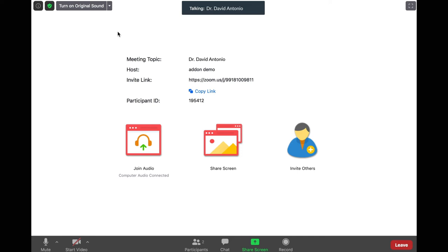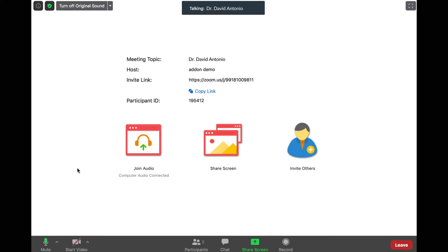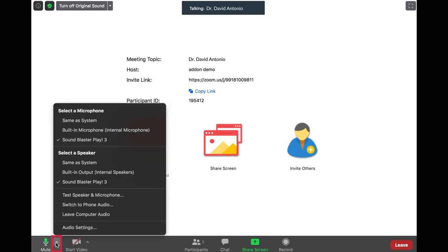When your provider is ready, plug in the device to the USB port. Enable the original sounds on the top left corner of your zoom screen. Click on the arrow next to mute and select the USB input in which the stethoscope is connected, in this case the Sound Blaster Play.